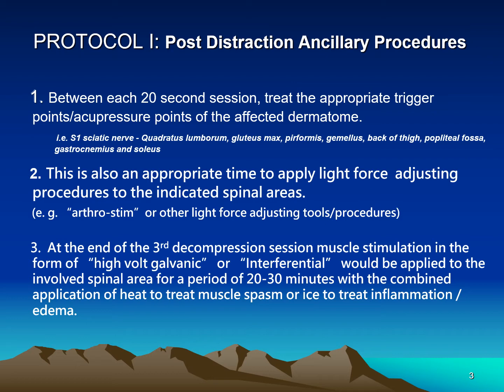At the end of the third decompression session, if you're utilizing physiologic therapeutics in your office, this would be the time to introduce them. We recommend high volt galvanic or interferential. Both reduce spasm and edema through increasing cellular permeability, and they give a little bump in endorphins as well. But it's typically a 4-pad therapy.